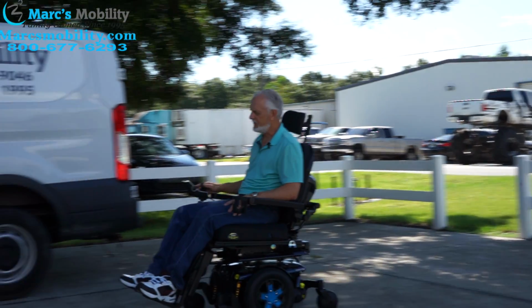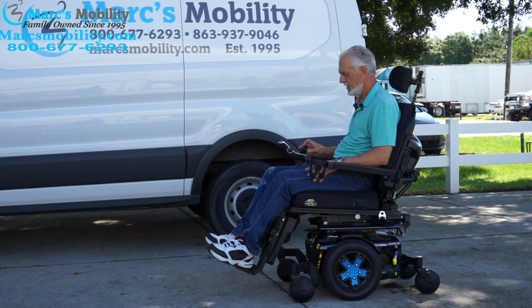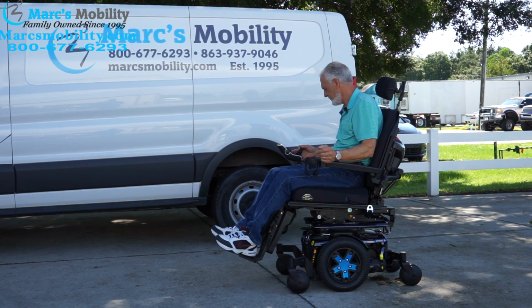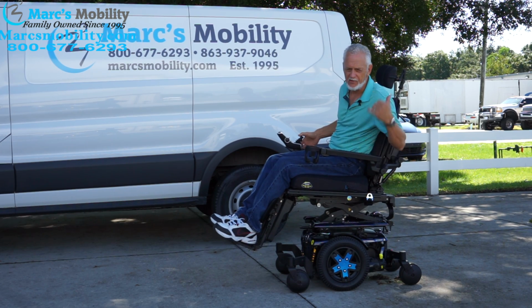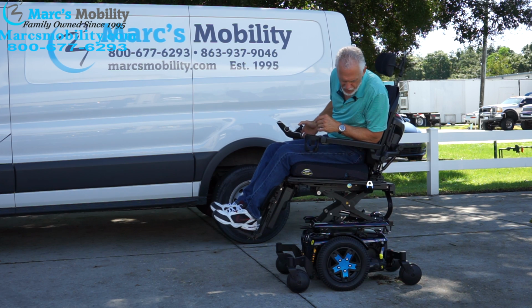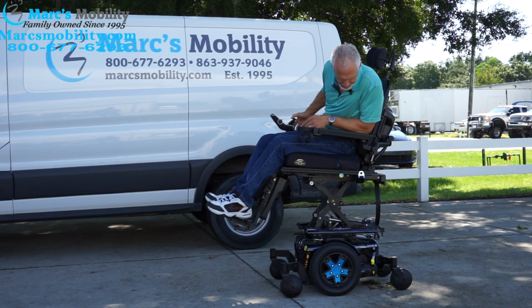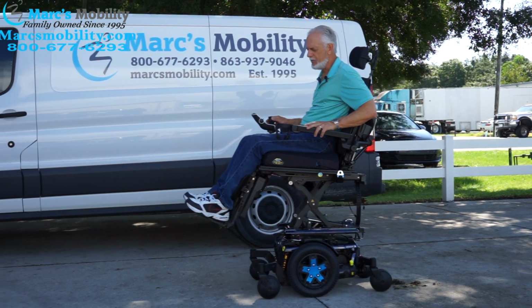So I'm going to raise the seat up so you can see the seat elevation. So as I said, this seat will go up 12 inches. If you're going to use the seat lift, make sure that you're on flat surface, not in the grass. And I know common sense is well advised with these chairs. They're great chairs and they're built fantastic, but they're not trucks. There we go. We're almost there. I'm going to put it back in drive. So you can see that this chair will drive with the seat elevated.